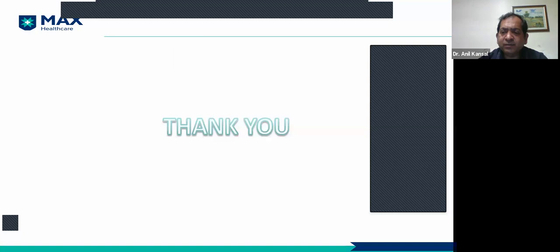Yes, please go ahead, sir. The major problem is that if we are not using a chargeable battery, we have to change the battery. Second, if there is any trauma, someday the electrode may disconnect or fail.